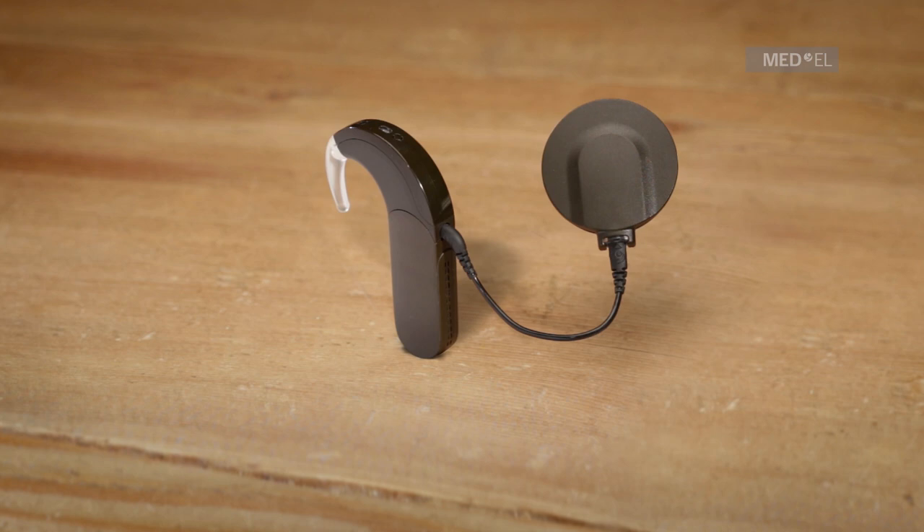This is applicable to Synchrony, Concerto, Medel Concert, Sonata, and Pulsar implants. One short green blink indicates that the DL coil, coil cable, and audio processor are working. This is only applicable to C40 Plus and C40 implants. No light indicates that either the link check feature has been disabled or Sonnet isn't working properly.